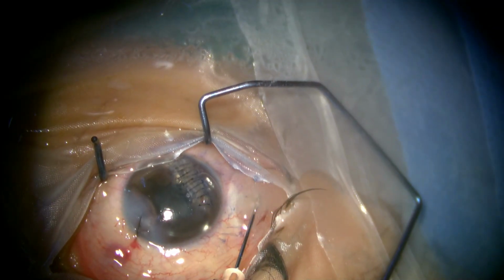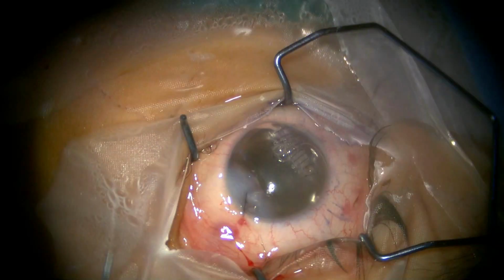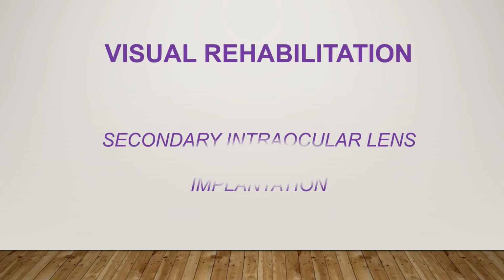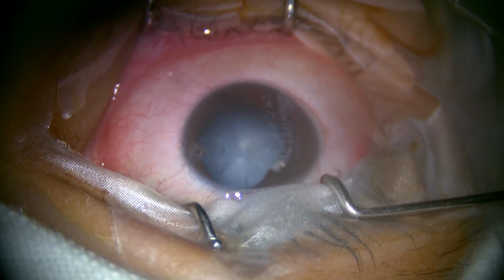Now the case is being closed. This is the final outcome of primary repair of open globe injury. After 2 months, visual rehabilitation for traumatic cataract was planned.